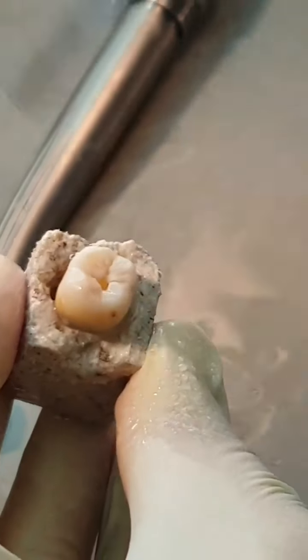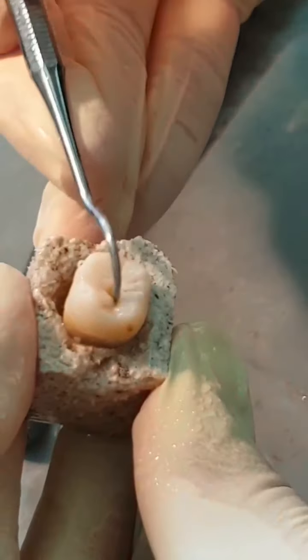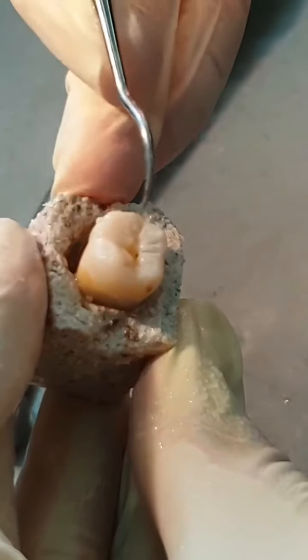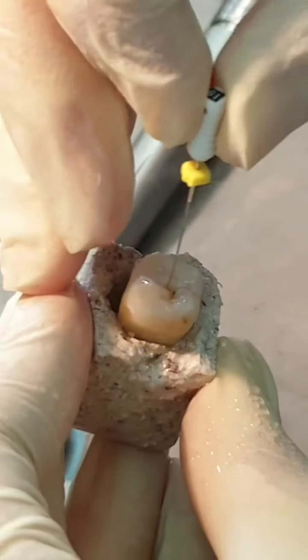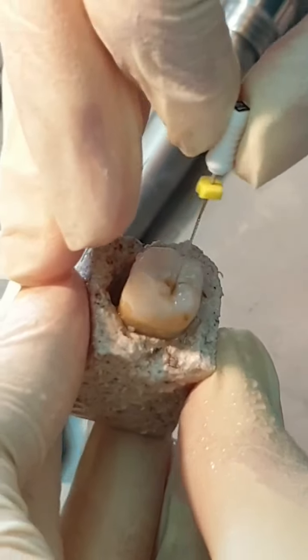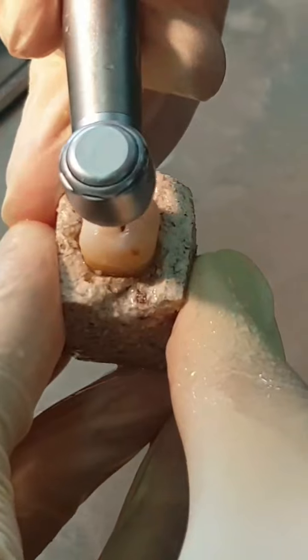Now, we are going to check with number 15 K file to find orifices after we check with Explorer. As you see, we can't enter any canal, so we are going to extend the access cavity a little bit more.